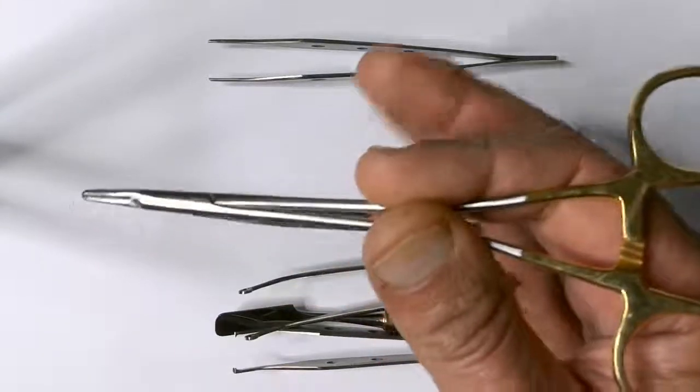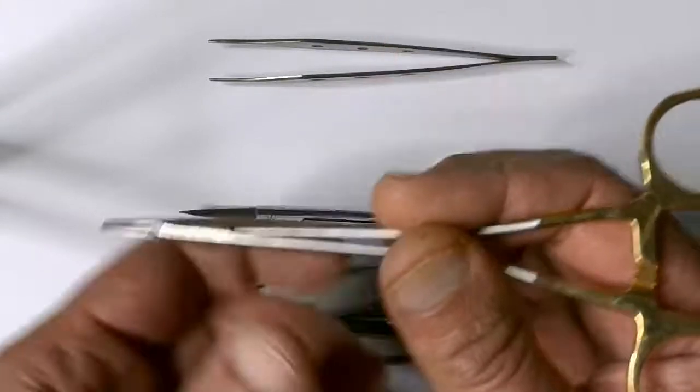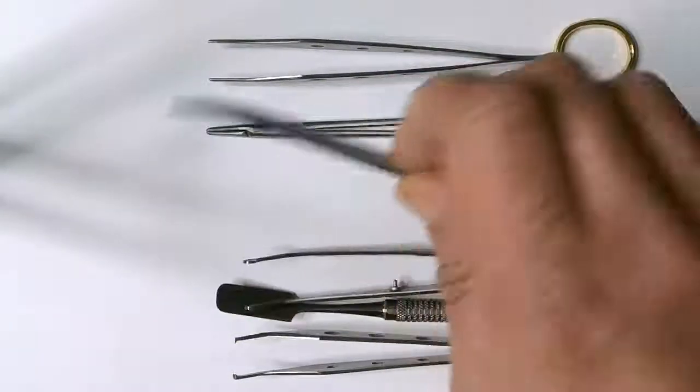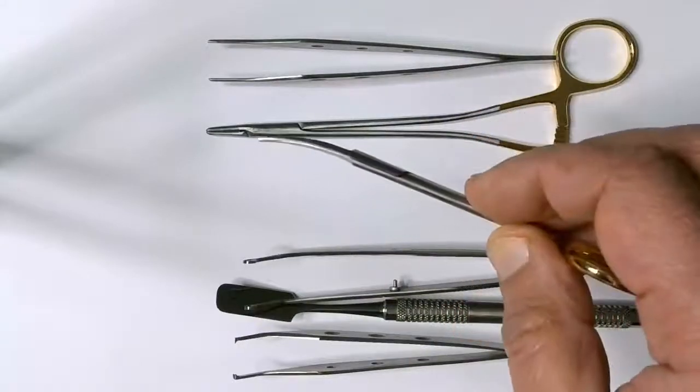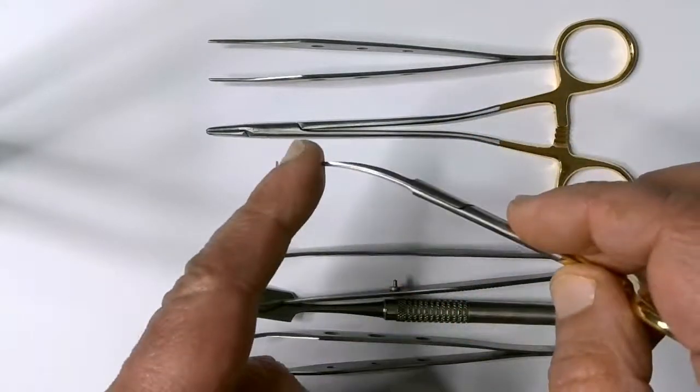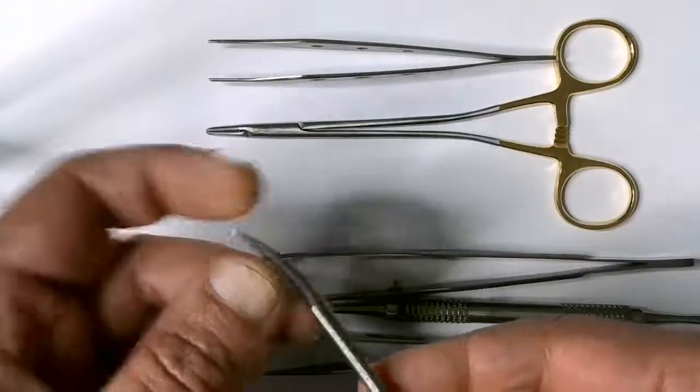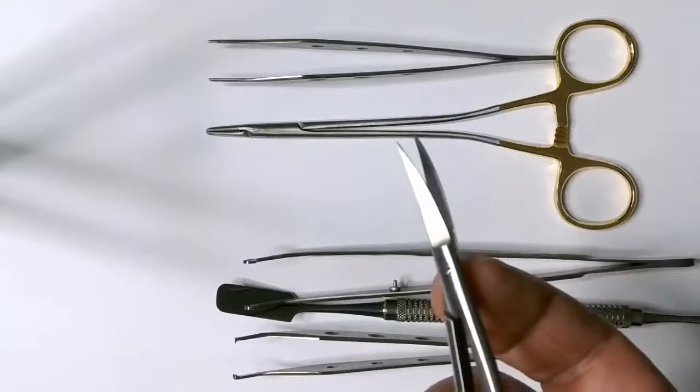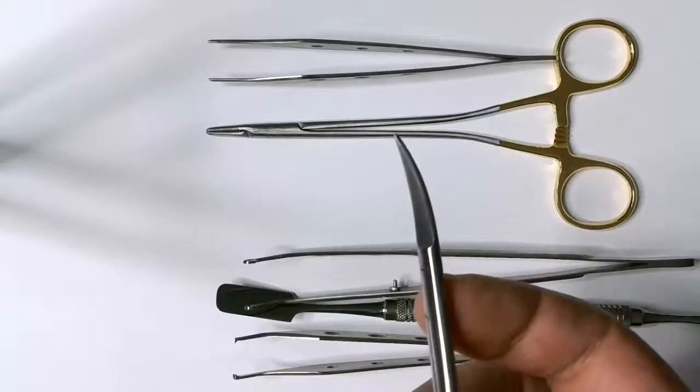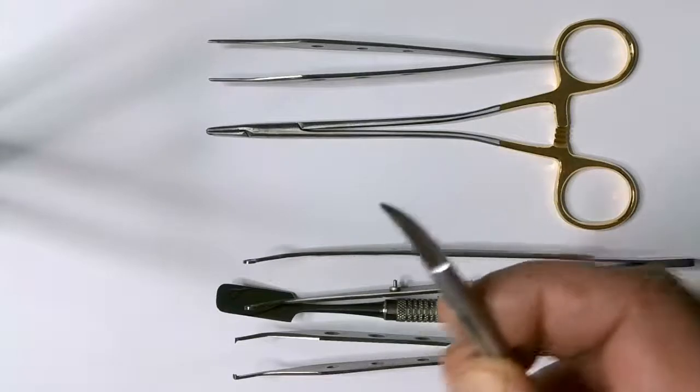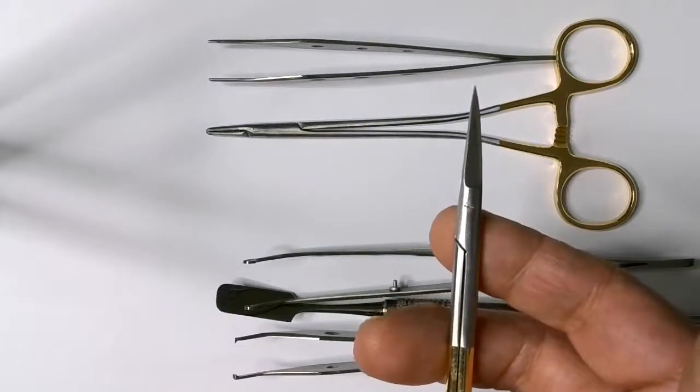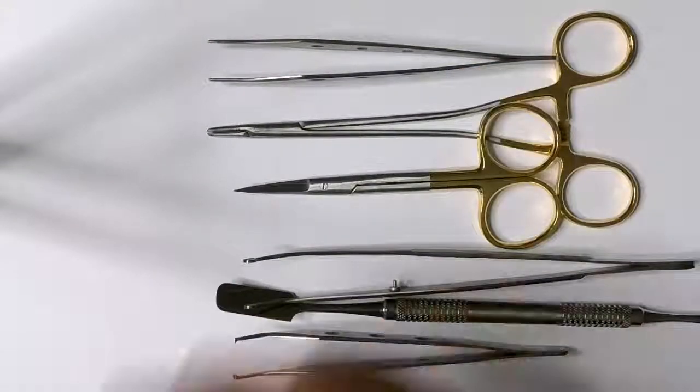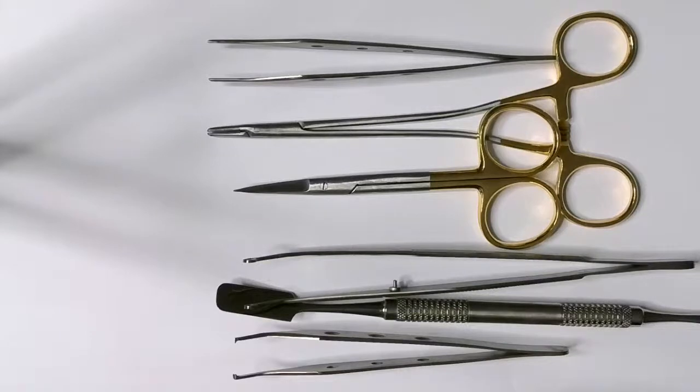So that's to hold the needle. Obviously some sharp scissors. I like the curved ones and they should cut with the end. There are certain ones which have a little notch at the end here to go under the suture and then cut it, and this is mainly for removing sutures rather than cutting the ends of sutures after you've finished off your knot and ready to cut the excess.